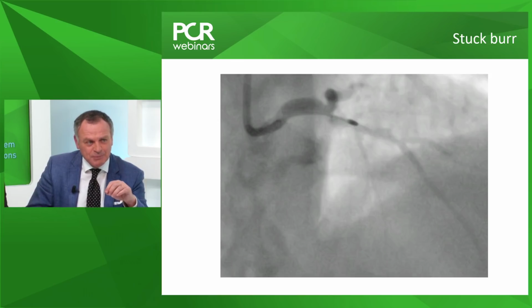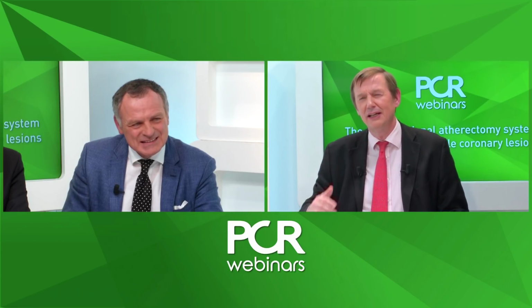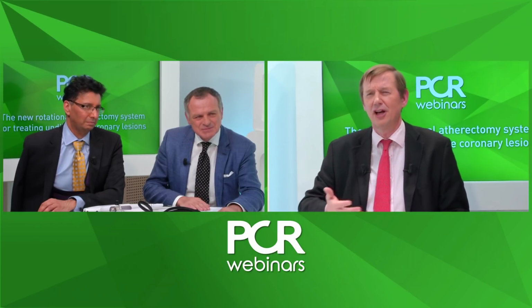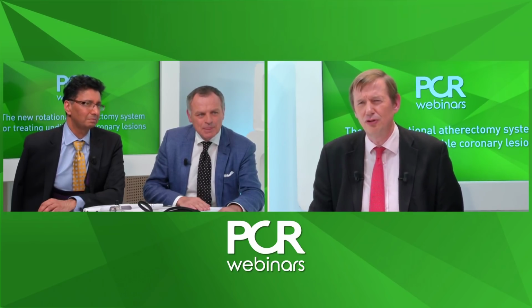It's the first point. Yes, it's always a rather depressing noise when you press the pedal and nothing happens and the burr's stuck. Clearly, if there's flow down the artery and there's no compromise in perfusion, it gives you a little bit of time to have a think about some solutions for this.